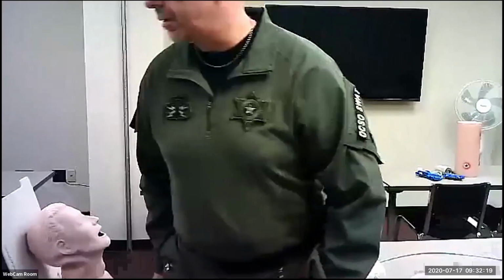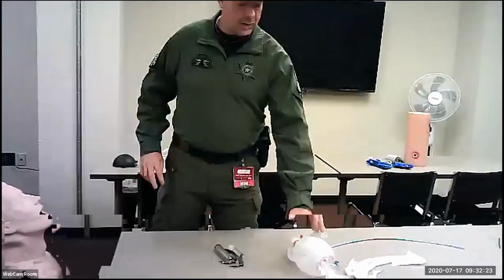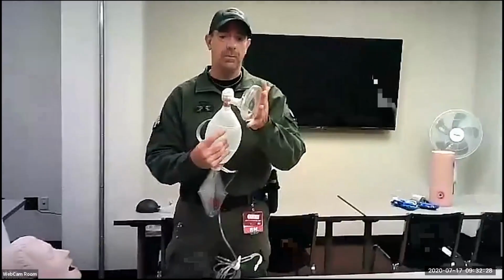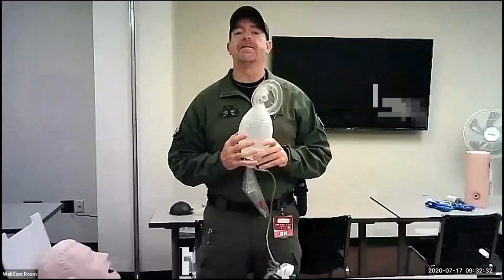All right, let's talk about a couple other things here as far as innovation. I mentioned in the video that we're going to bag them. When I say bag, we're basically breathing for them. What we're doing is we're denitrogenating them.